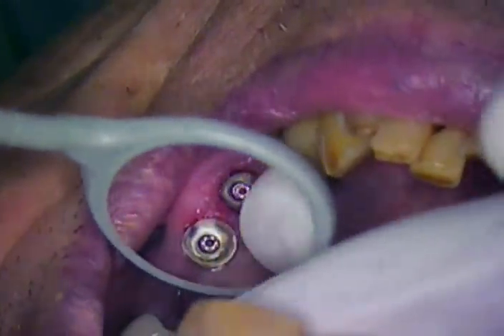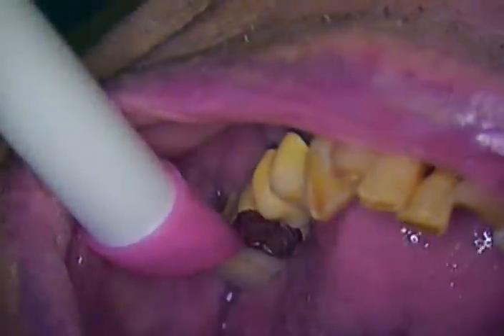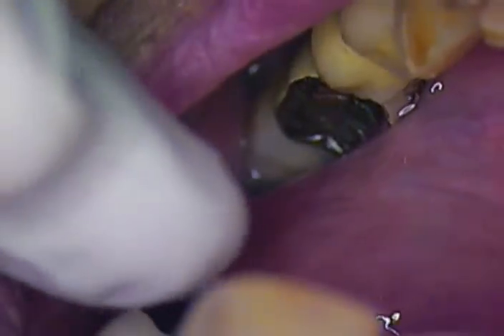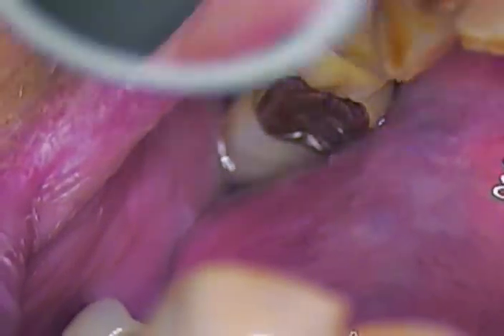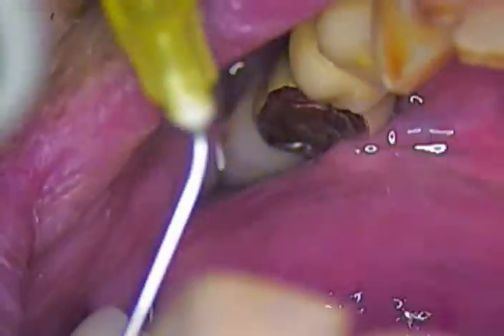Does that bother you at all, Joel? We're good. We're ready to take the next one off. There it comes. And we'll take another look at that — tissue looks fairly decent, we'll blow that up on the screen.